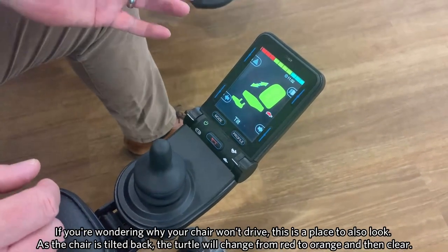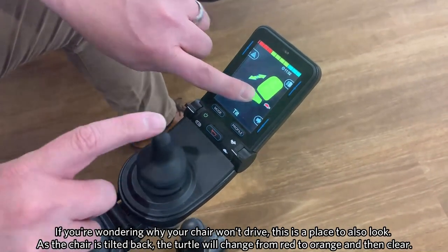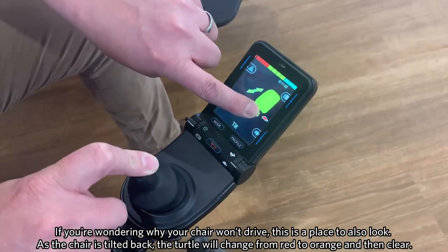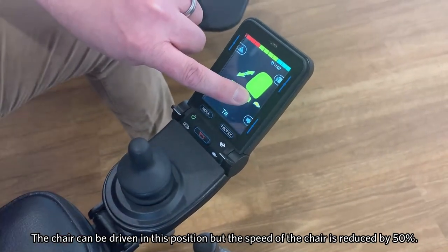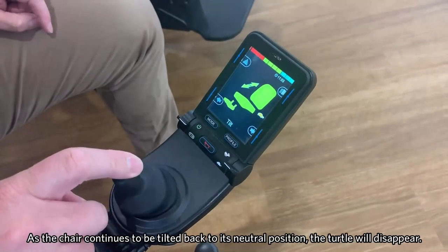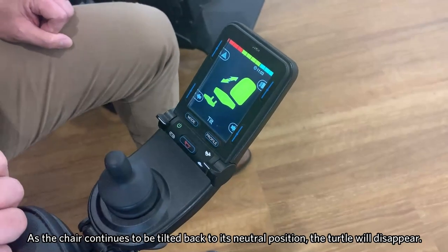So if you're wondering why your chair won't drive for a particular reason, this is a place to also look. But as I tilt the chair back, you'll see that turtle go from red to orange and then it will clear. We can drive in this position — it just means that the speed of the chair has been reduced by 50 percent. And then as I pull back on the joystick and get back to that neutral position, you'll see that turtle disappear.